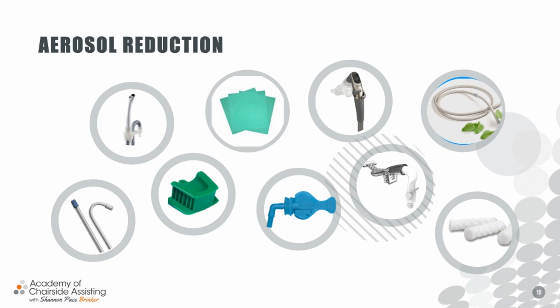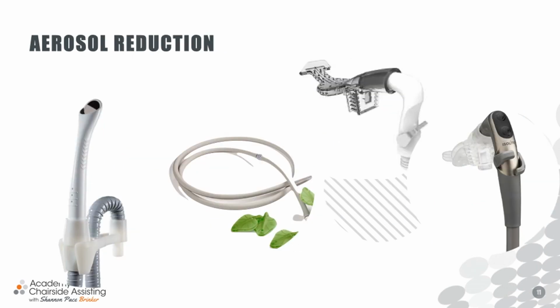But again, going back to the HVE, we know that they say around 90%, but this number keeps changing and going up. I'm seeing now from various resources anywhere from 94 to 96. And for me, I love that number going up and hope it continues to go up. But tonight, we're going to focus on several different aerosol reduction devices, and I want to talk to you about those.